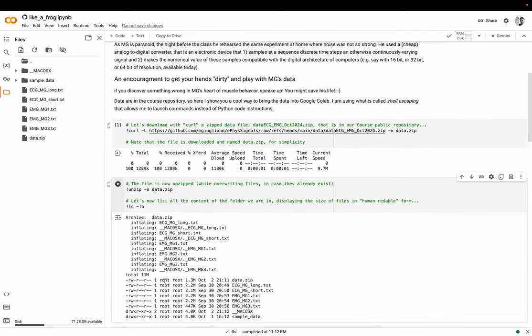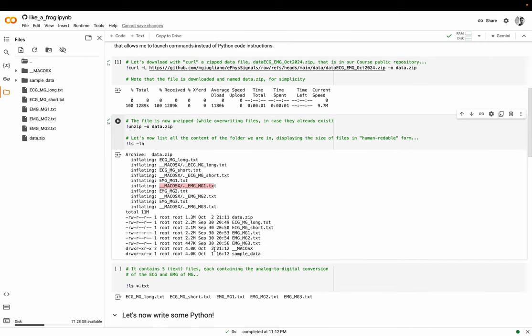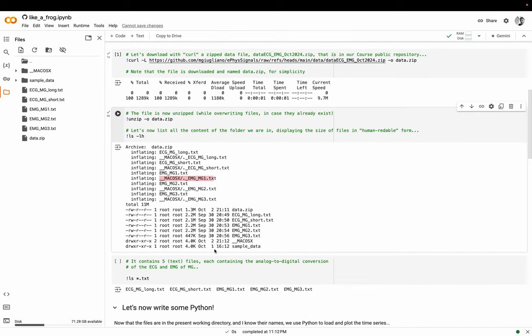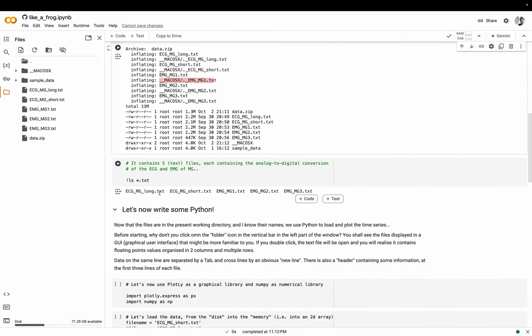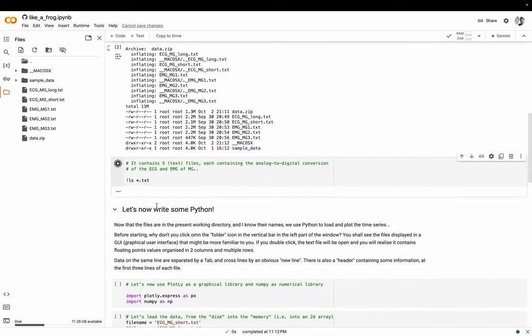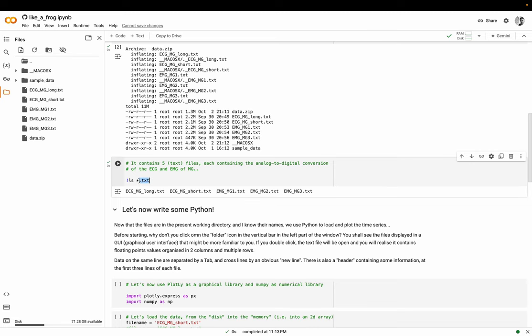Now you can list the files. The files are listed here. Forget about these ones with underscore Mac OS X - these are housekeeping files that being on a Mac I inadvertently created. We can list only the txt files, the files that are ending with txt. The file name is whatever with this asterisk, which means whatever.